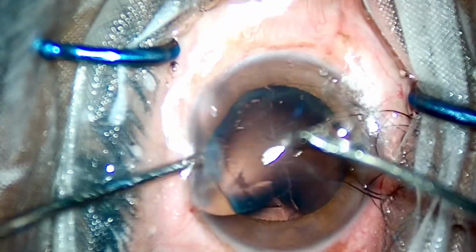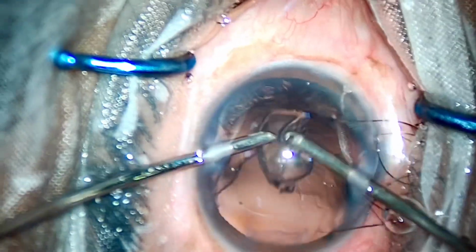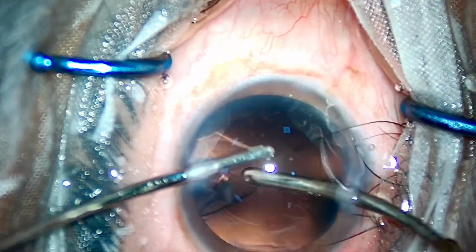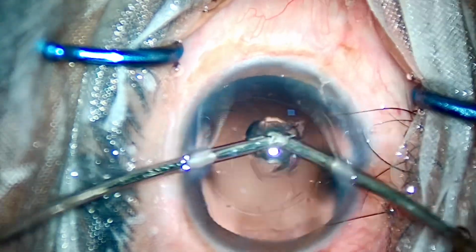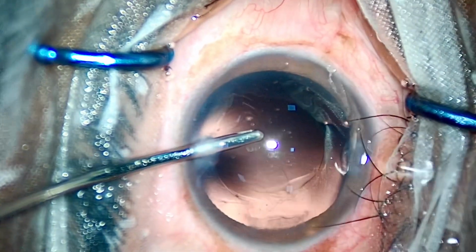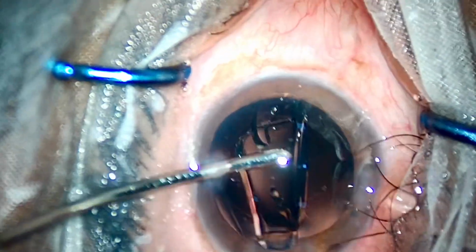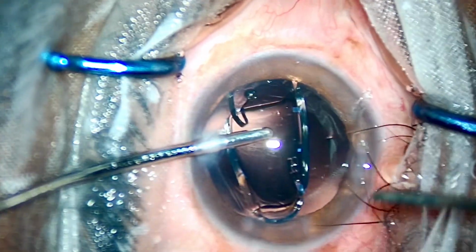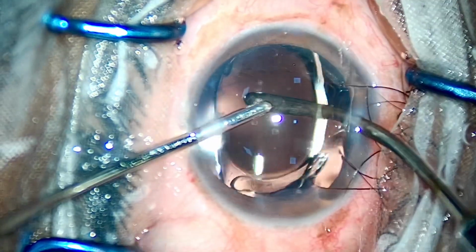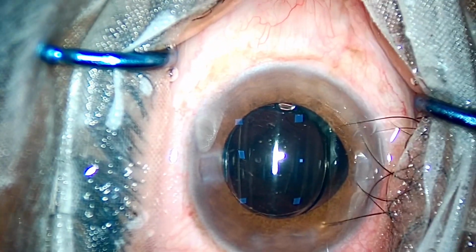One point to note, which I told you earlier as well, is it is always good practice to do irrigation and aspiration with bimanual cannulas. I have used coaxial just once in my life. I was always in the habit of using bimanual for I and A because the coaxial cannula, being thick, when you put it inside the main port, causes gaping of the main port, increasing the chances of surgically induced astigmatism.